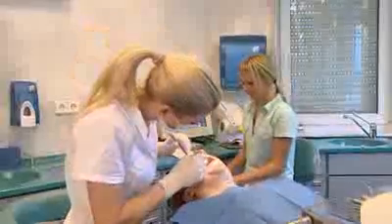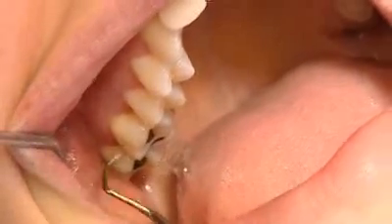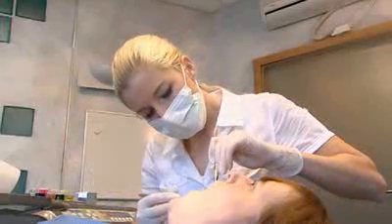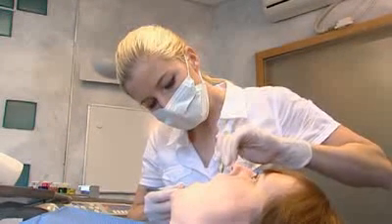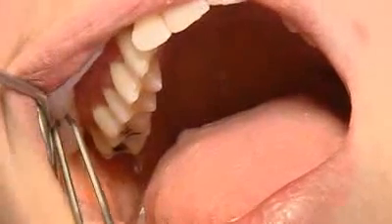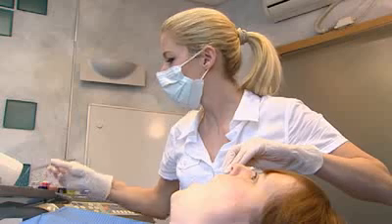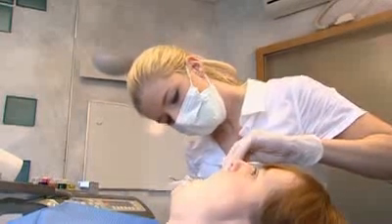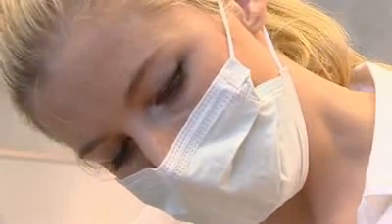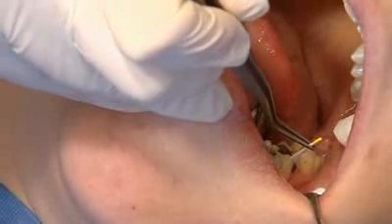Prior to taking specimens, the supragingival plaque must first be removed with a sterile curette, and the specimen site must be dried with sterile cotton swabs. This ensures that the result is accurate and that the paper points pick up only the subgingival specimen material. Moderate bleeding does not affect the specimen or the result. However, specimens should not be taken from very suppurative pockets.